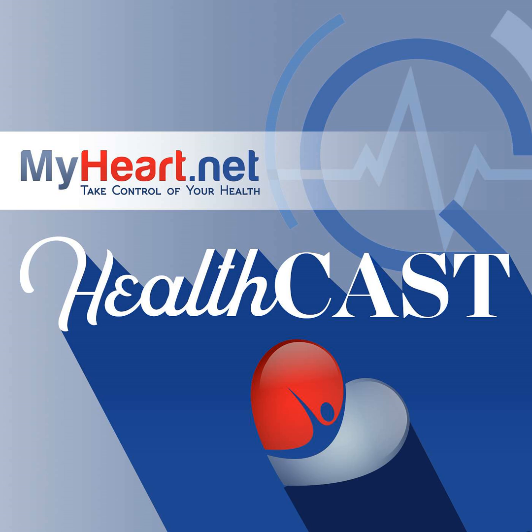What about the calcium that is incidentally evaluated? Let's say we have a patient coming to the emergency room for atypical chest pain, and we want to rule out aortic dissection and PTE. We do a CT that is non-cardiac gated, and then we see some calcium. Are you doing this at UAB, reporting the amount of calcium in those patients? Because it seems like it has a good relationship with the actual calcium score and maybe even the prognosis in these patients.